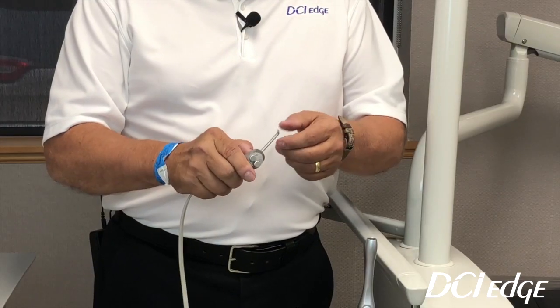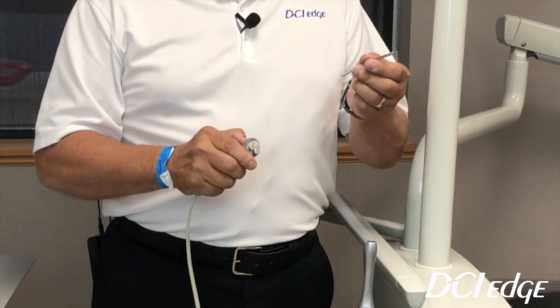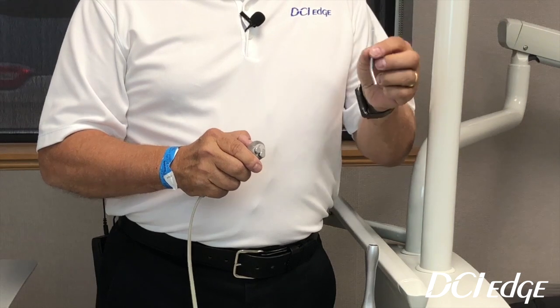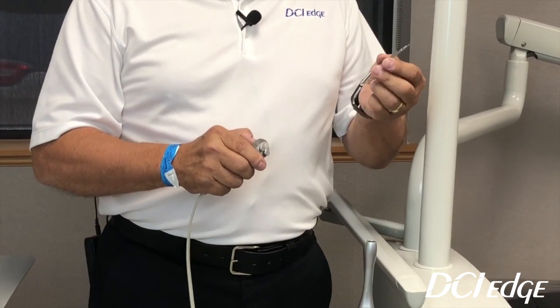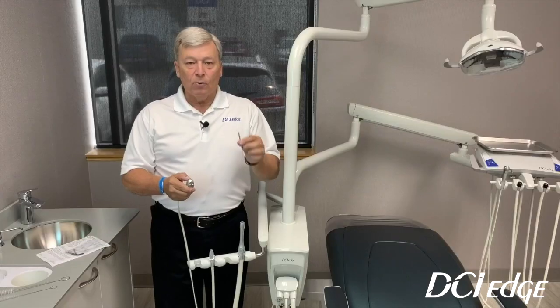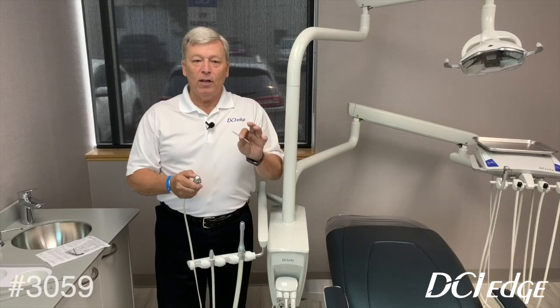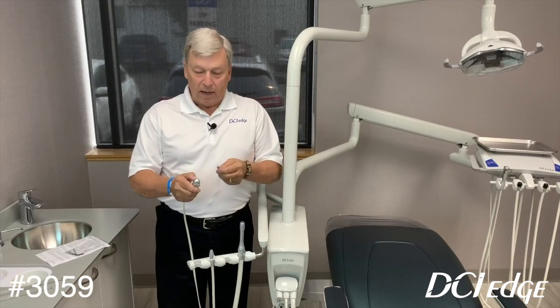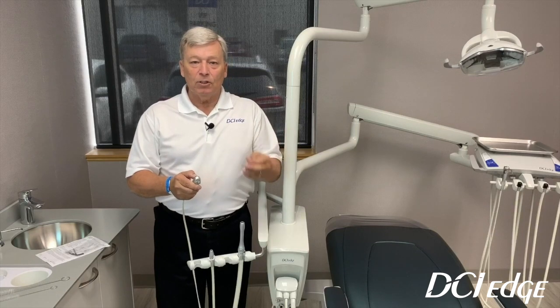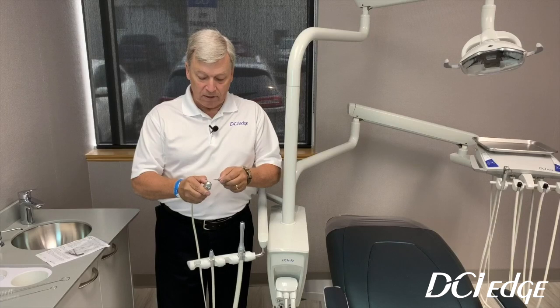The syringe tip we supply is an autoclavable syringe tip, and these should actually be changed each time — you will keep these on your instrument tray and bring them in for each patient. To order additional syringe tips, the part number is 3059. You can get multiple tips and keep them on your instrument trays and bring them in with a new set of instruments.